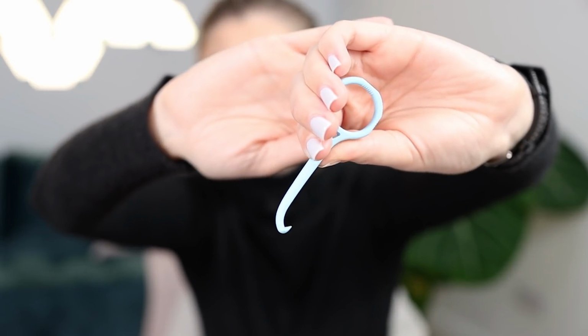If you haven't seen it, I'll hold it just in front of my top there, like that. You can see that it has a little hook on it. Don't go super hard with it. Just be gentle. If you haven't used a lot of force, stop and just find a different place to hook it. I'm kind of learning the best places to unhinge mine, but it does get easier. And obviously throughout the week that you wear it, whether you change yours weekly or monthly, towards the end of a tray it's going to get a bit easier to come in and out anyway. So you will get the hang of it.